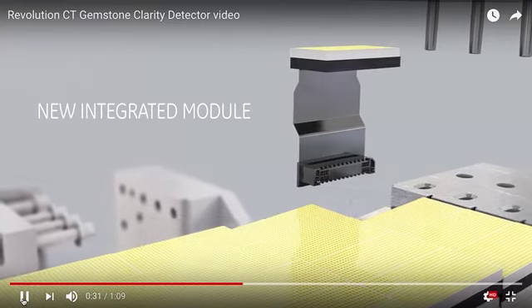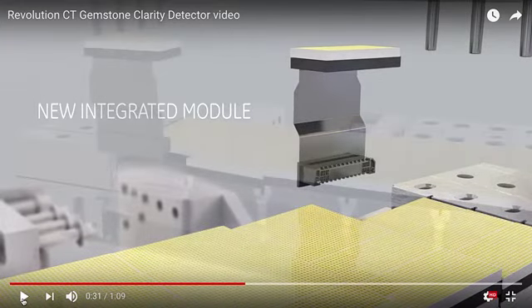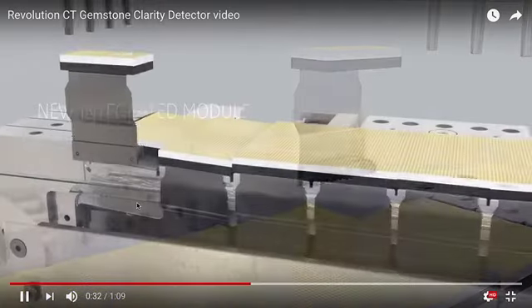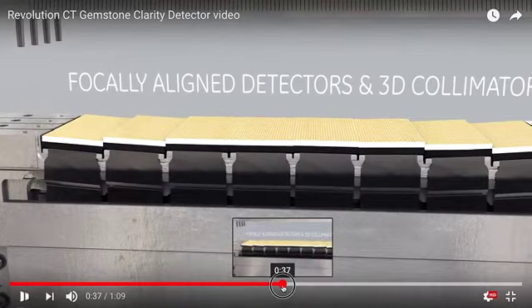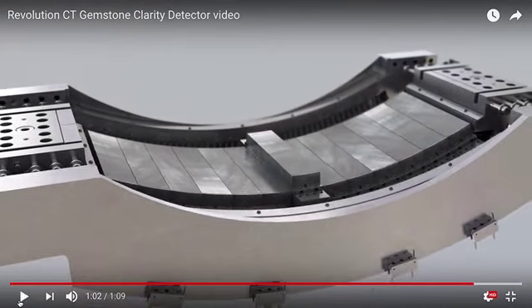So it's just a digital camera for X-rays. Your digital camera in your phone is nowadays something like 2K by 3K. This thing is 832 by 256, but it's a very special digital camera. It's an X-ray digital camera. And so that whole thing is stacked together, and then we bring it back into place here. There are, I think, 832 by 256 detectors on there.